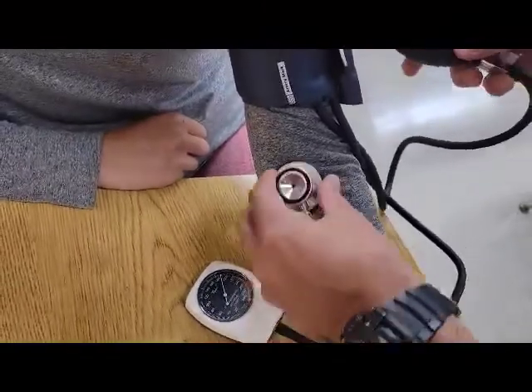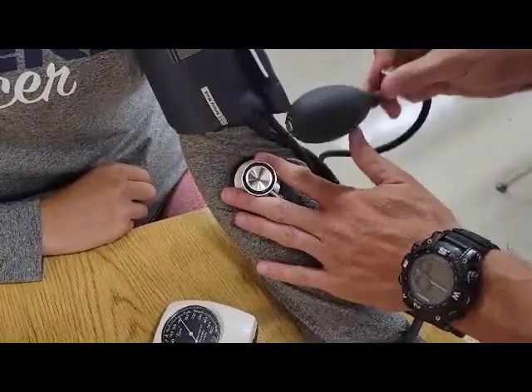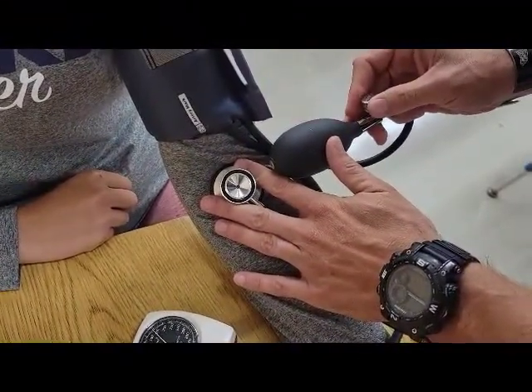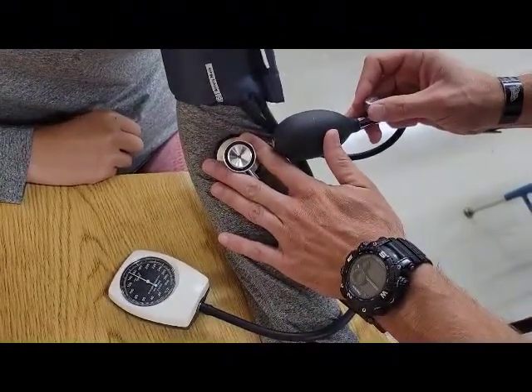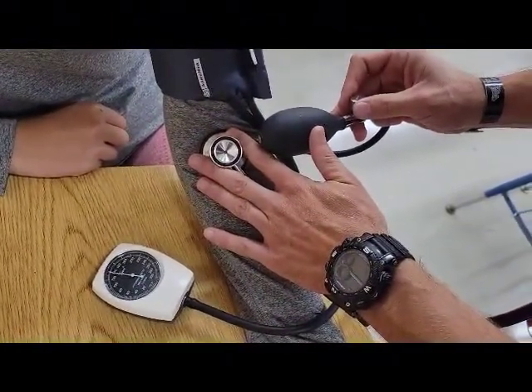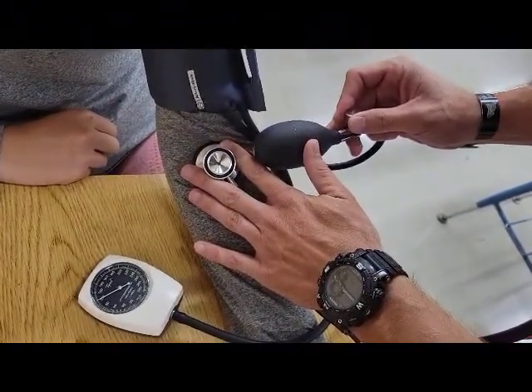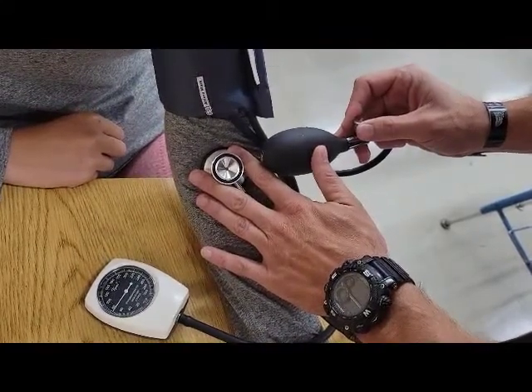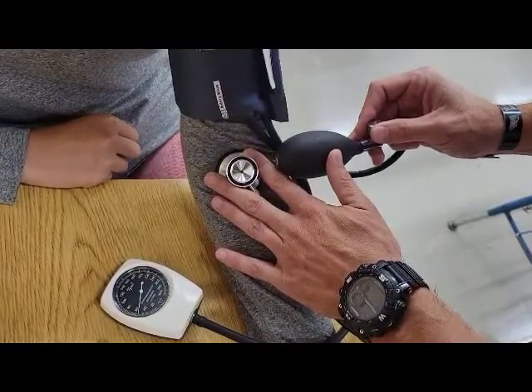Once we're there, we're going to place the stethoscope right on the antecubital area. And we're going to slowly let out the air and listen for the first sound. And let out the rest of the air.